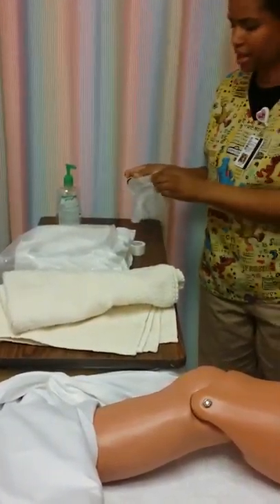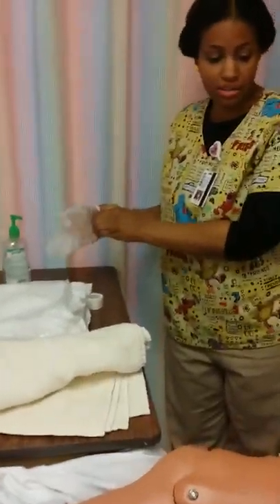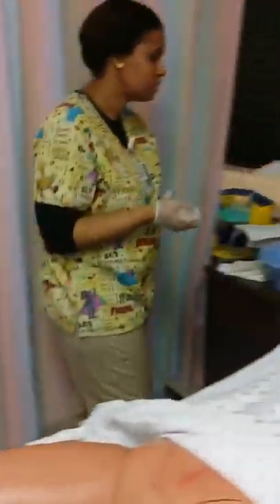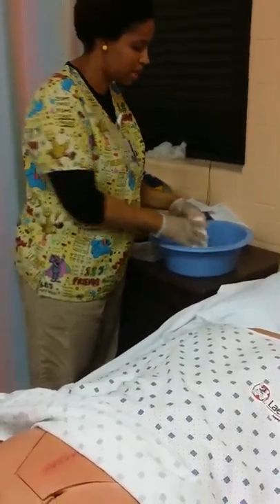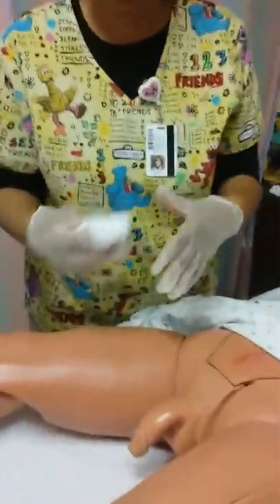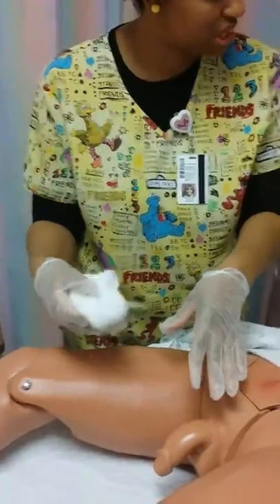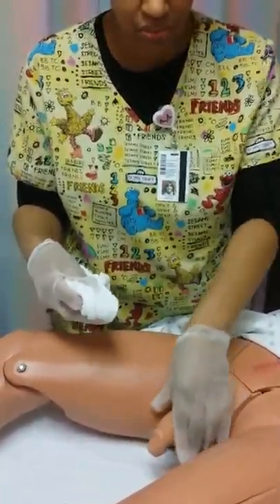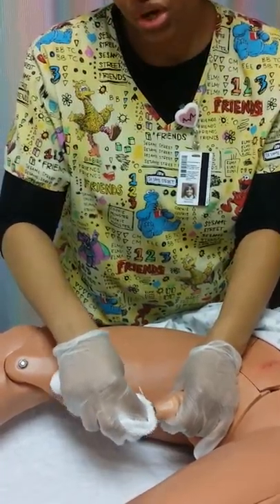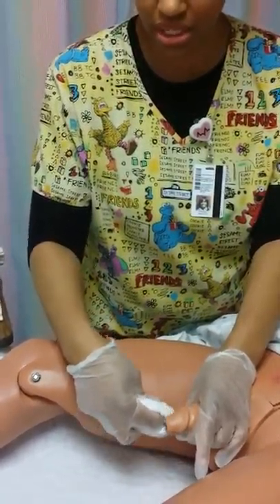Then I'm going to apply my clean gloves, because I'm going to clean the meatus before I insert the catheter, just trying to cut down on infection and bacteria. Over here I have my soapy warm water and my towel. I'm going to squeeze the towel out and approach my patient, and talk to him while I'm cleaning so he won't feel so uncomfortable. I'm going to clean your penis right now before I insert the catheter, okay? This water is kind of warm, hopefully it's to your liking. I'm going to hold his penis, and then clean the meatus in a circular motion. They prefer three times. So that's one, two, three, circling around it three times, okay?